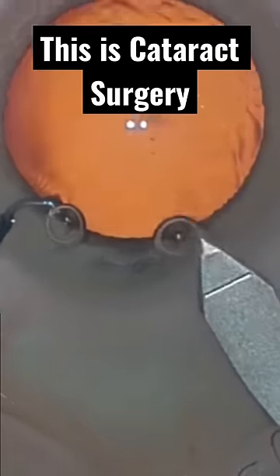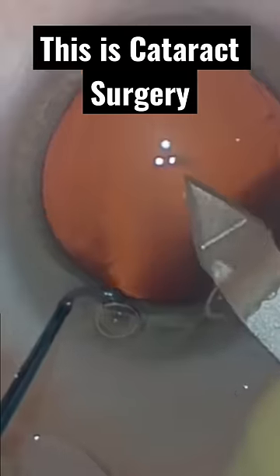A slightly larger incision is made through the clear cornea about three o'clock hours away from the smaller incision. We remove the cataract through this incision.